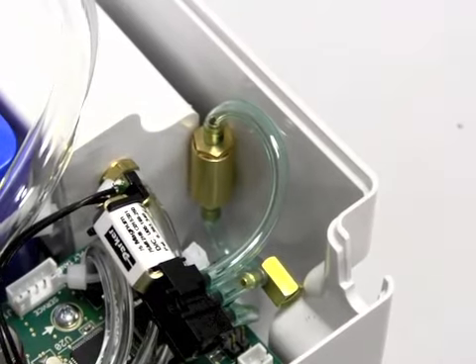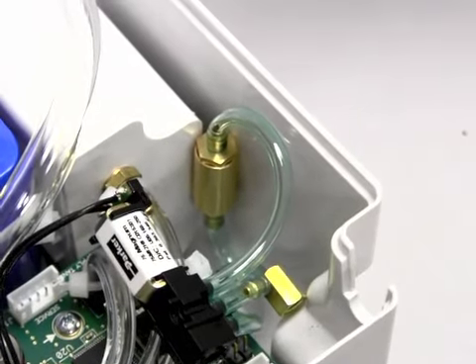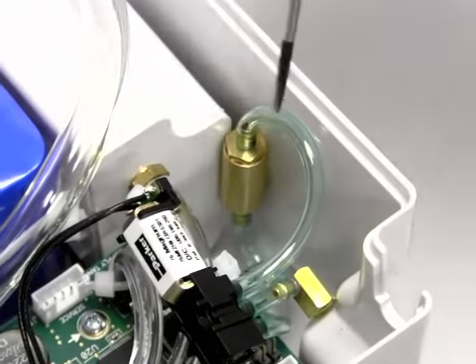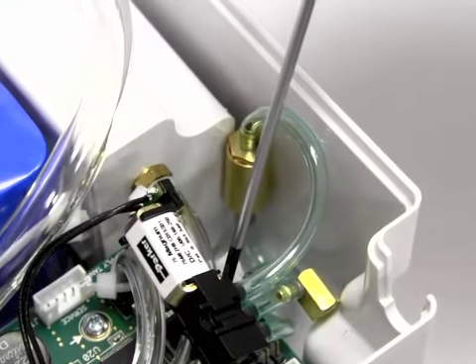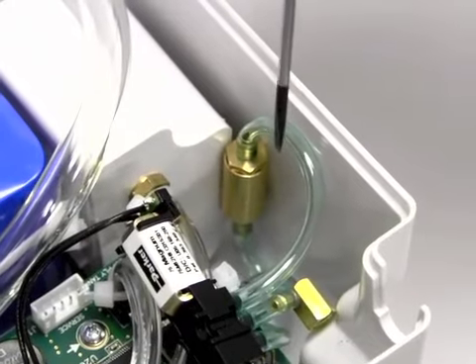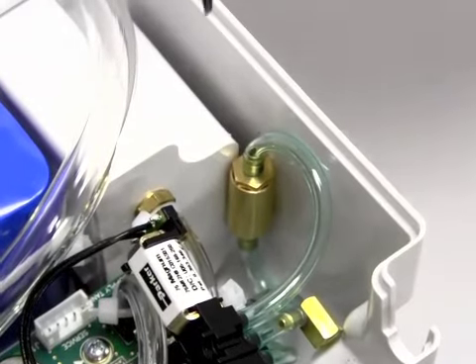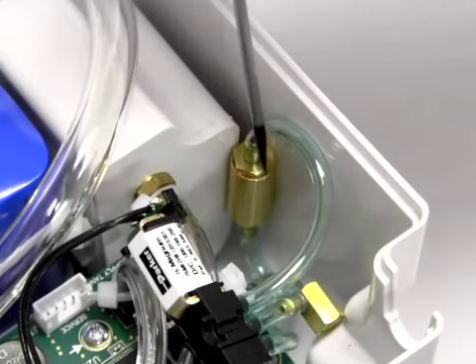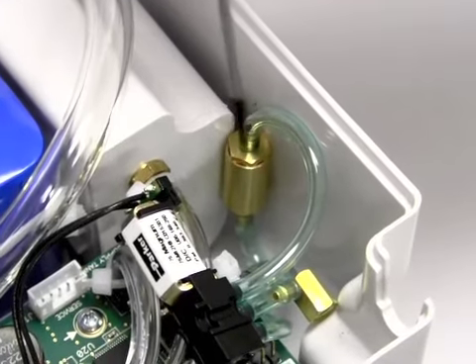This shows that I have now installed the isolation valve, connecting it to the three-way valve and onto the pressure sensor, and the tubing is in place. Please note that the isolation valve is laying on top of the reservoir, and the way it is located.